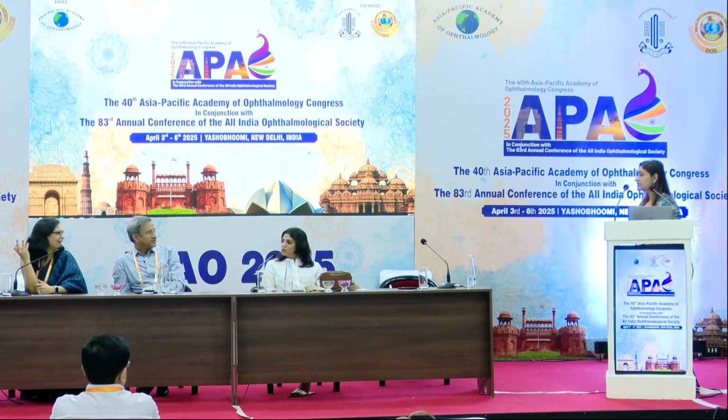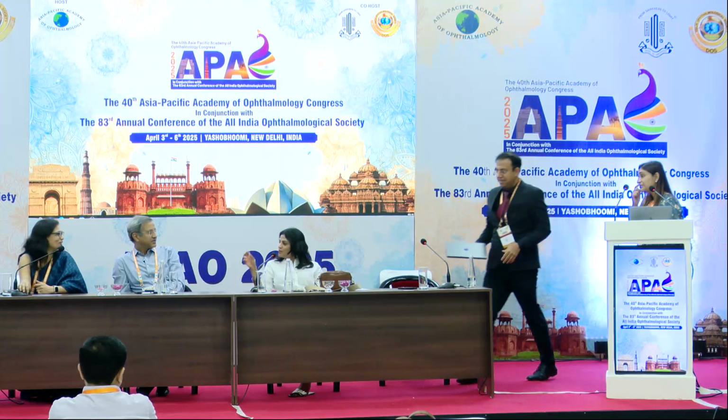So I randomly decided that if it is more than 3 months, we should repeat, especially in toric IOLs. There is no guideline for this. But surprisingly, I have found changes. Especially if you're planning a toric IOL, then it's a must. Very important. Just for your own psychological satisfaction, it is required. But yes, we have seen that more or less it doesn't change. With toric IOLs I have seen changes, it does change, and it can.